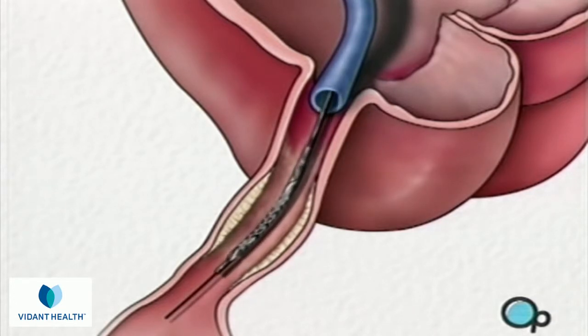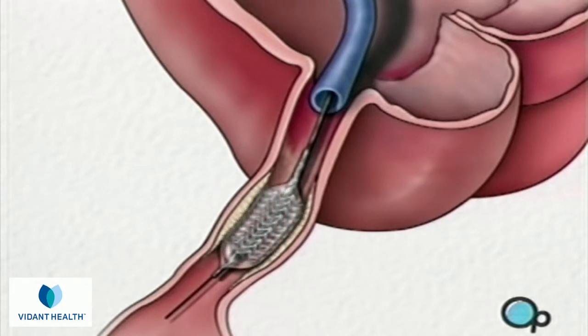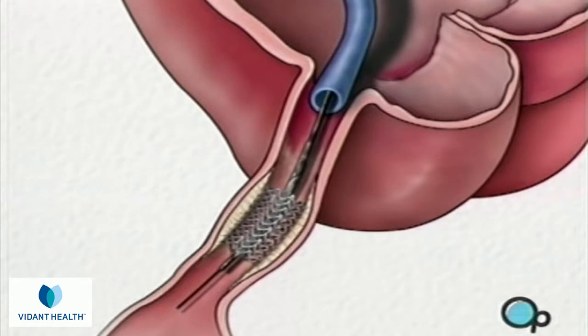Once this tube has been placed in the center of the now widened area of the artery, the balloon is briefly inflated. The stent expands until it hugs the walls of the artery. Finally, after a thorough investigation of the region, the catheter and guide wire are withdrawn, and the stent remains permanently to provide support to the artery and to resist the buildup of plaque.